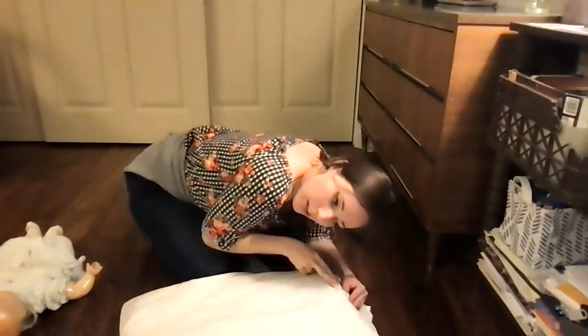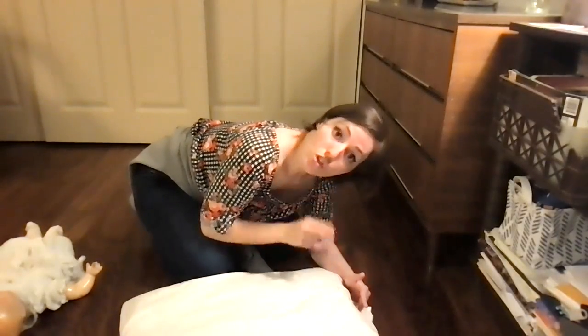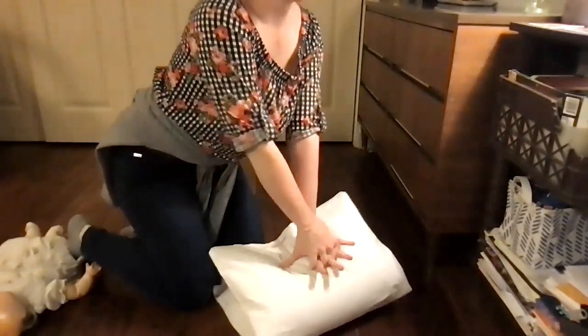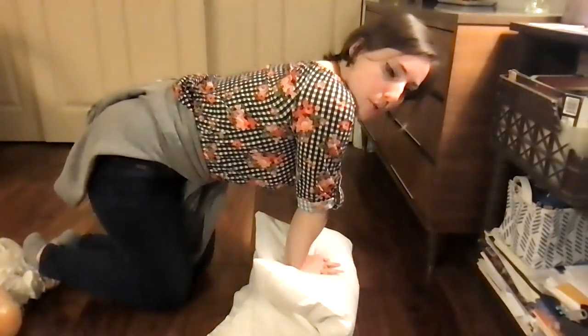Then you're gonna feel the person's carotid and look at their chest at the same time for 10 seconds, see if you feel any pulse or if you see any rise in their chest. If you don't see either of these, start CPR immediately. So that's gonna mean you're gonna interlock your fingers, put your shoulders over your hands, lock your arms, put your body weight straight over, and give 30 compressions at a rate of 100 to 120 beats per minute, making sure that the chest is recoiling fully.